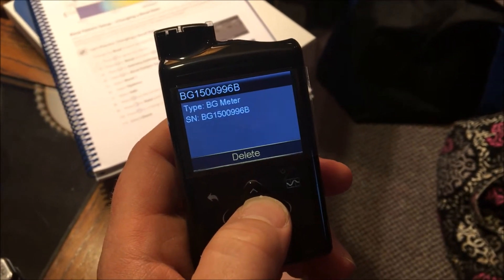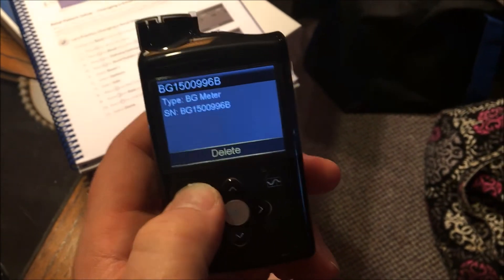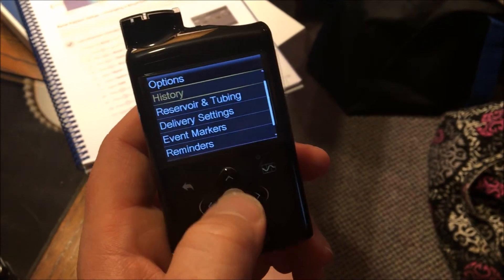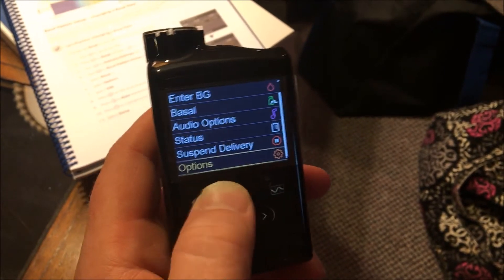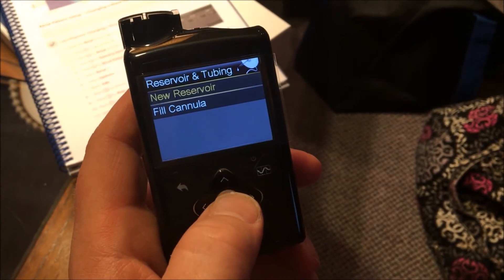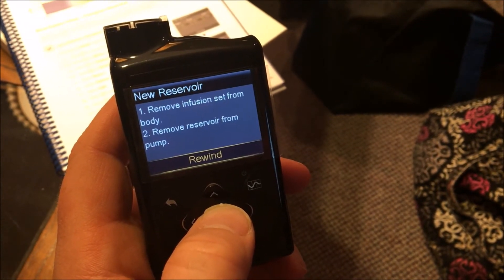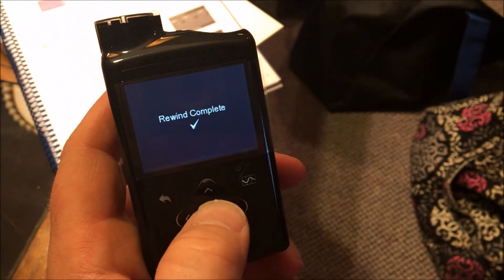I accidentally navigated to 'delete device' — I don't want to do that — so I'll hit back to the main screen. We're going to need to fill this with insulin. We'll go to Options, then Reservoir and Tubing. We have a new reservoir. It says: remove infusion set from body, remove reservoir from pump, and rewind. There's nothing in there yet, so we'll rewind it. Rewind complete — perfect.